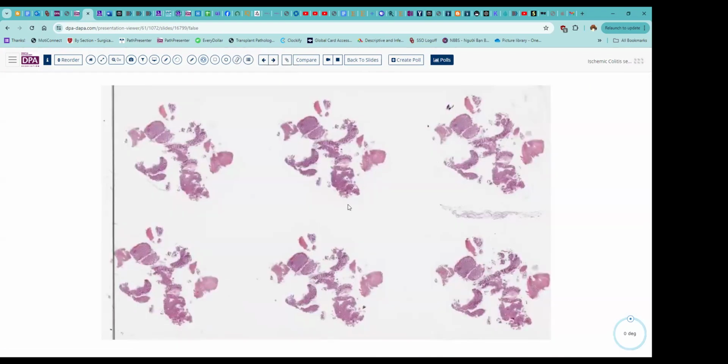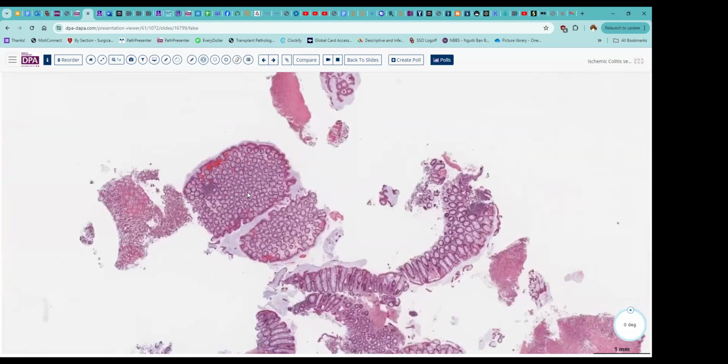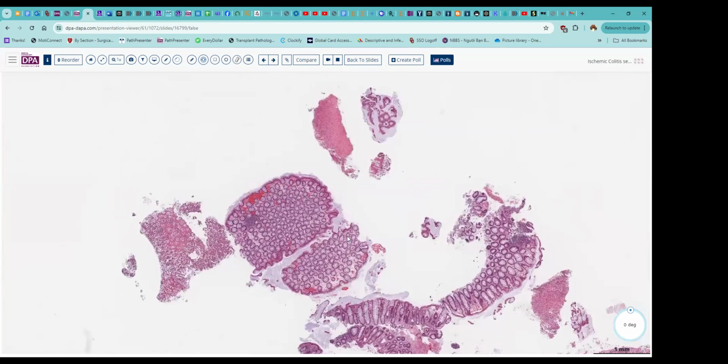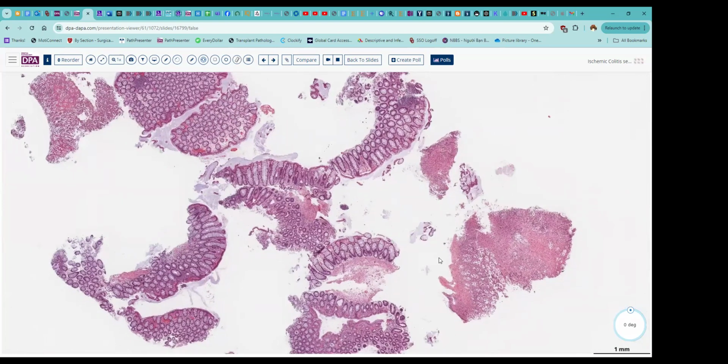So this is another patient and another pattern. This is, as you can see here, maybe not as blue, and we actually have some pinker areas, a very lost pattern of glands with some sort of dropout here. So we see some normal areas. Here's an abnormal area. Here's, I don't know, it looks necrotic type of area, maybe an exudate. Here's more of this pattern. And then here's an area that's sort of in between.